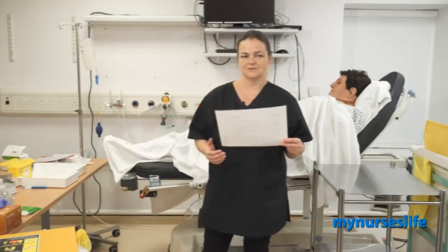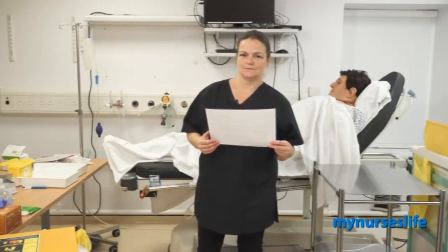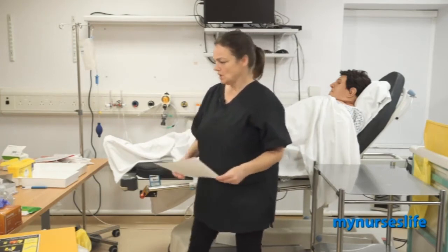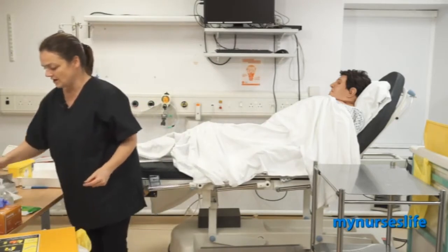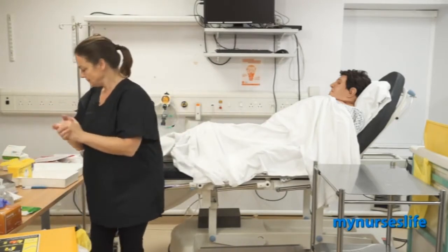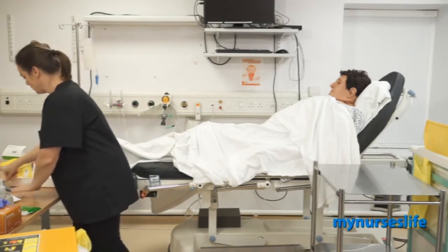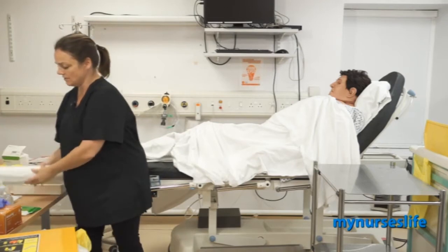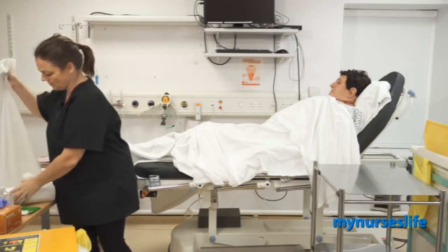Fine. So I'm going to go and prepare your insulin. Is it left out for me? It's on the table in my bedroom. All right, I'll go and find it and I'll be back in a few minutes, okay. So, because I'm leaving the patient area, I'll just give my hands a quick social hand wash. And I would assume this tray has been washed with soap and water in the past 24 hours, and I'll put an apron on.